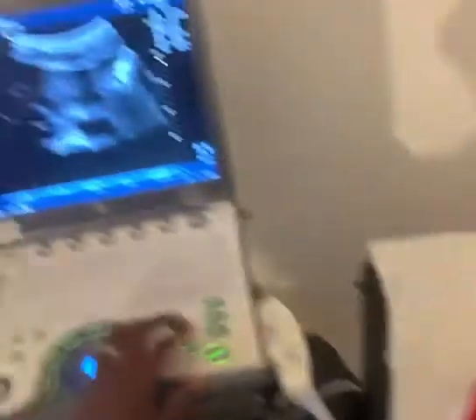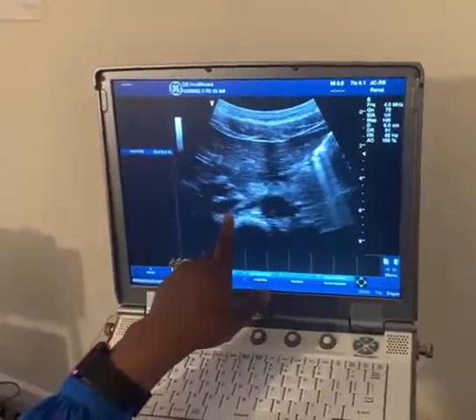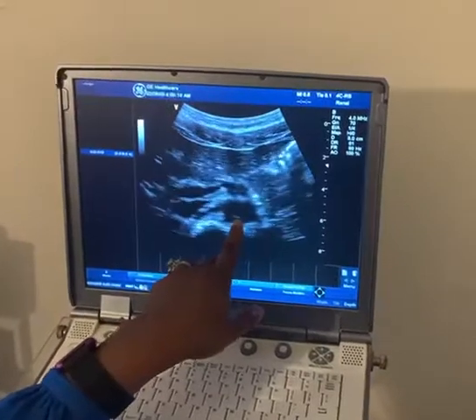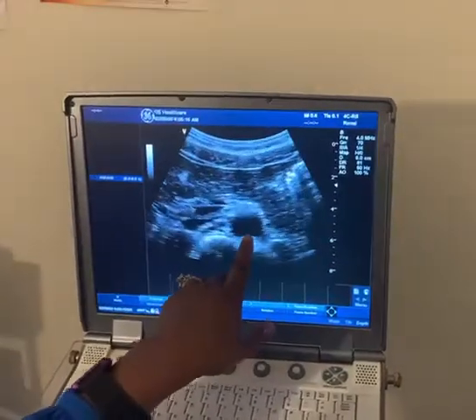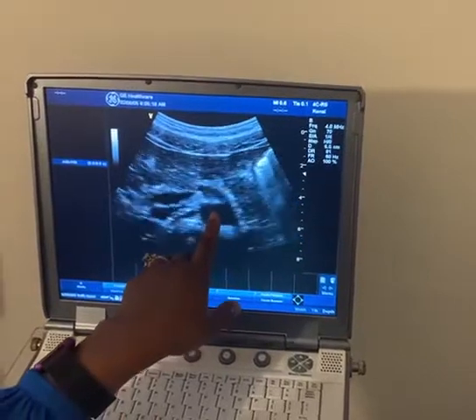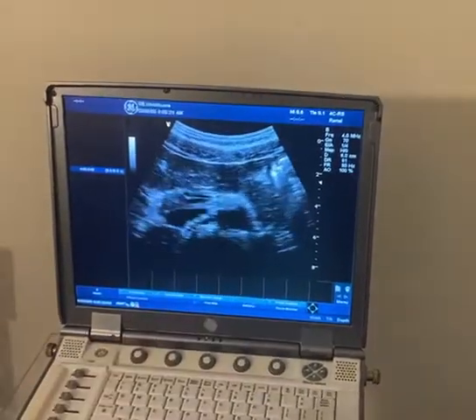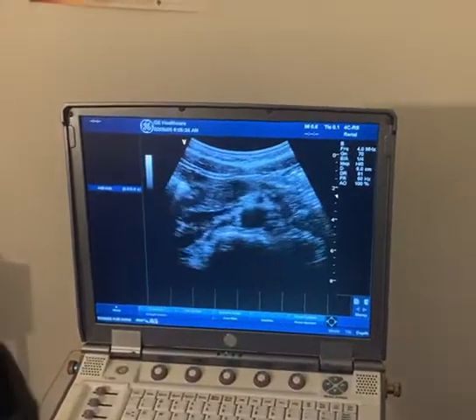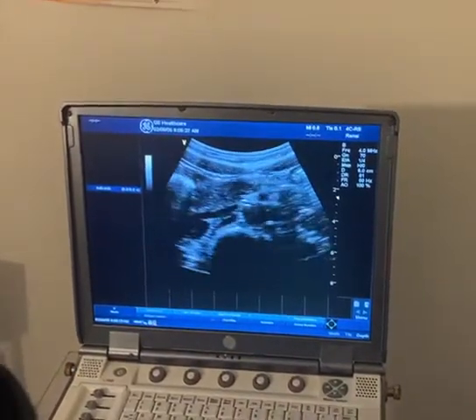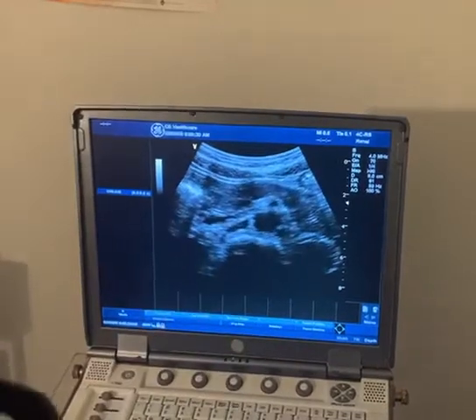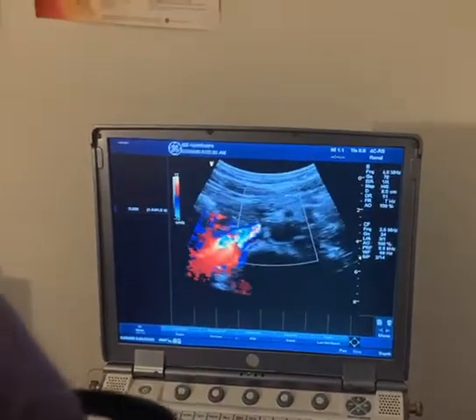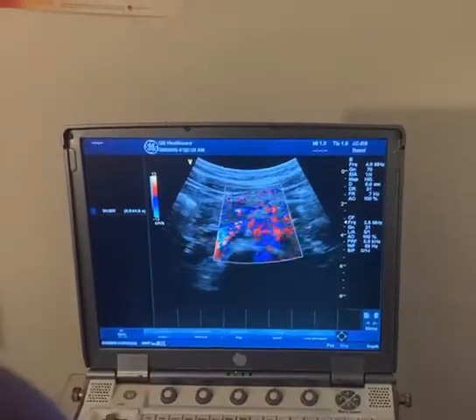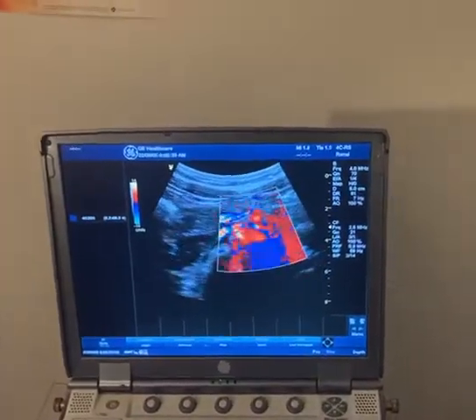Looking at my screen here, you can see our inferior vena cava — the IVC — and the proximal aorta. As I come down the proximal aorta, you can see the celiac artery taking off right at that segment. As I come down further, you can see the SMA, your superior mesenteric artery. As I slowly come further down, you can see the right renal artery taking off. If I put color on that, you can appreciate that right renal artery, and you can see the right taking off on that side and the left taking off as well.